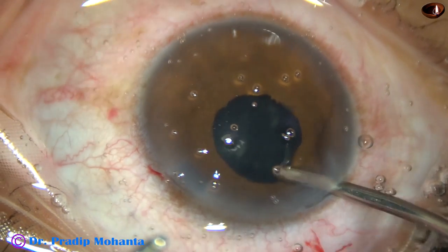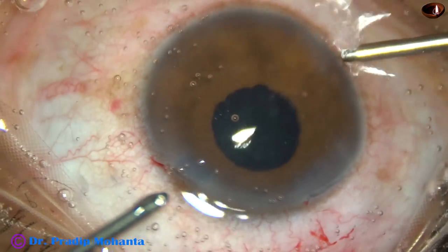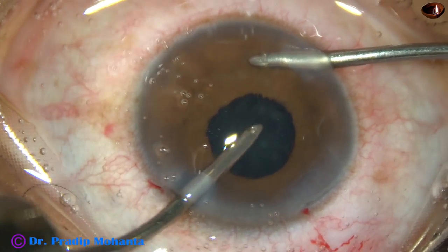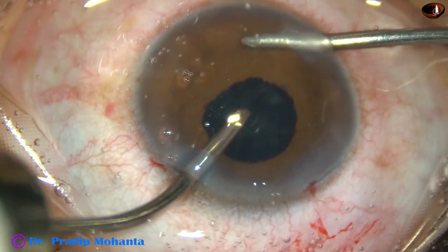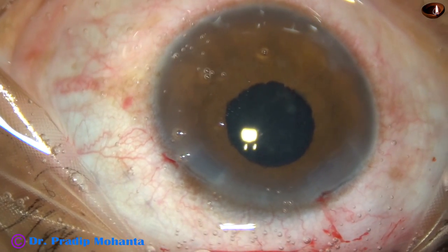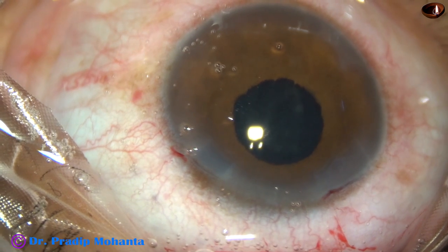You don't need any injector system to apply or to remove this pupil expander. I'm a big fan of this device — not necessarily of the inventor personally, but I respect the inventor and I am proud of him because he is from Kolkata, the biggest city of Eastern India.